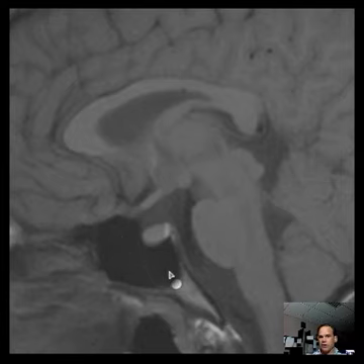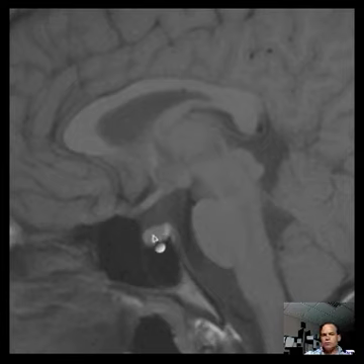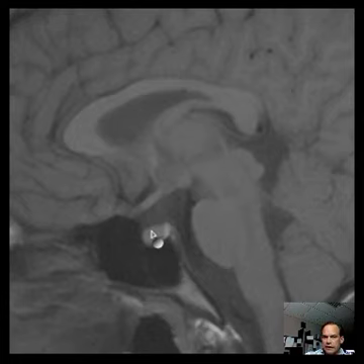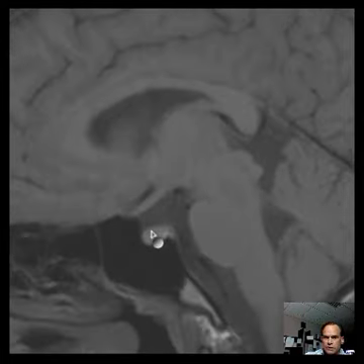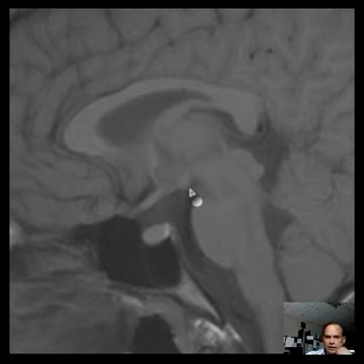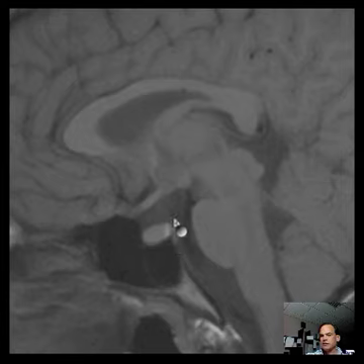Over here you have the sphenoid sinus — black, containing air, no signal. And here is the sella turcica, something like the camel's saddle, which contains the pituitary gland. Here is bone in the sella turcica, and there's the pituitary gland nicely demonstrated. The brighter signal is the posterior pituitary, and the less bright signal is the anterior pituitary. The hypothalamus is right around here and comes down via the pituitary infundibulum to modulate the pituitary.